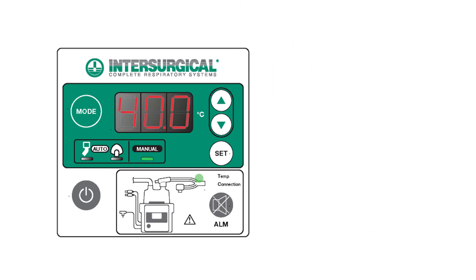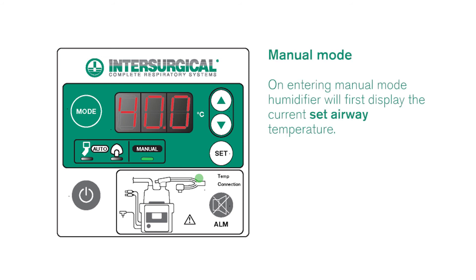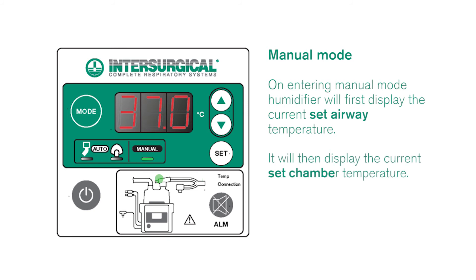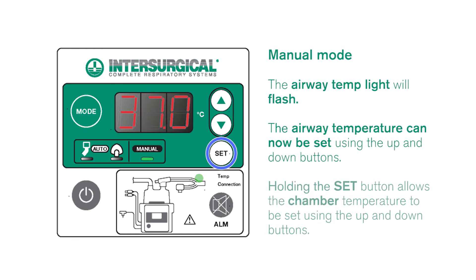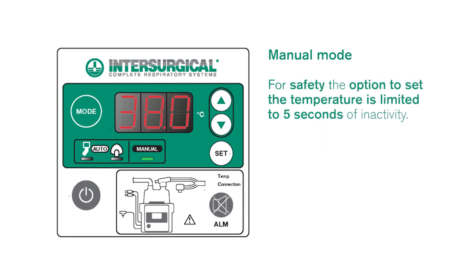On entering manual mode the humidifier will first display the current set airway temperature, followed by the current set chamber temperature. The airway temperature light will then flash indicating that you can now set the preferred temperature at the airway probe using the up and down buttons. Holding the set button allows the chamber temperature to be set using the up and down buttons. As a safety feature the option to set the temperature is limited to five seconds of inactivity.